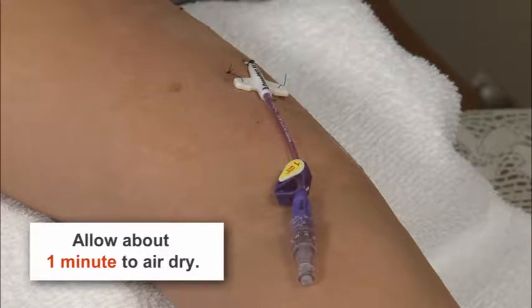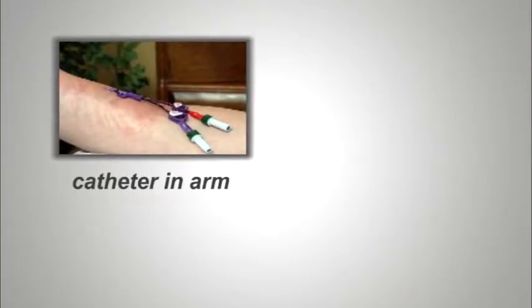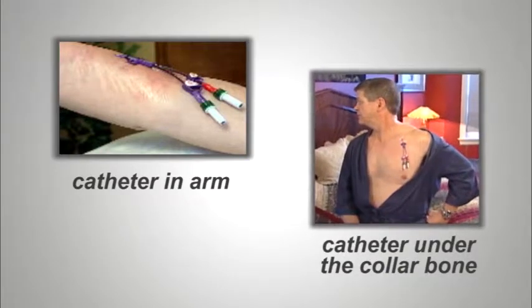The next step is to apply the dressing. Before placing the dressing, if your catheter is in your arm, extend your arm fully out straight. If your catheter is under your collarbone, turn your head to the opposite side and place your hand on your hip, pulling your shoulder back. These positions will stretch your skin out and keep your dressing from being too tight and pinching your skin.